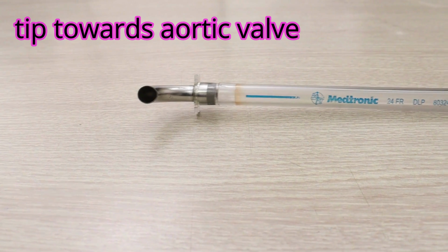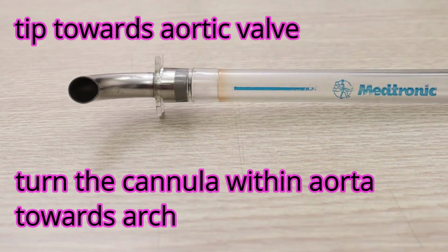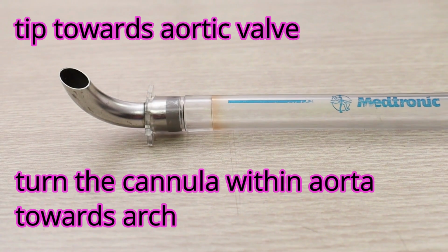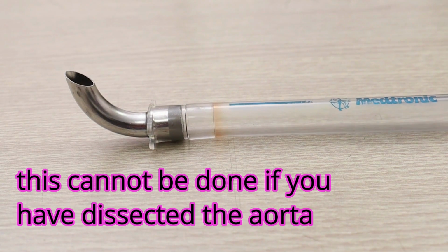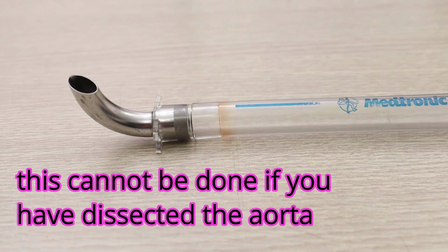you may get a higher gradient or the perfusionist may complain of higher gradient, in which case you have to turn the cannula within the aorta towards the arch. This would be possible only when you are in the lumen of the ascending aorta, therefore 100% eliminating the risk of dissection, which is iatrogenic.